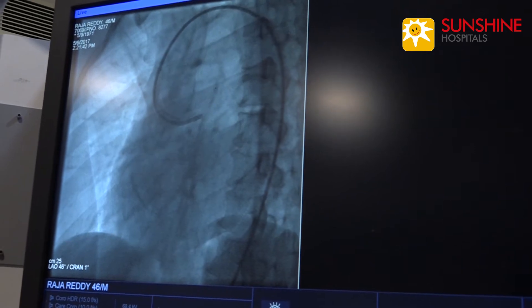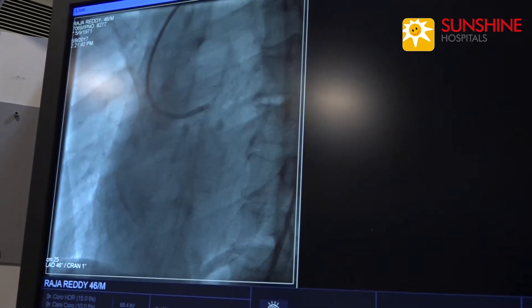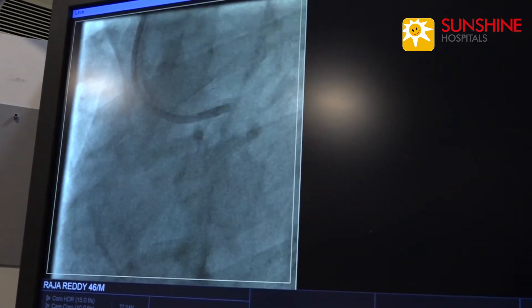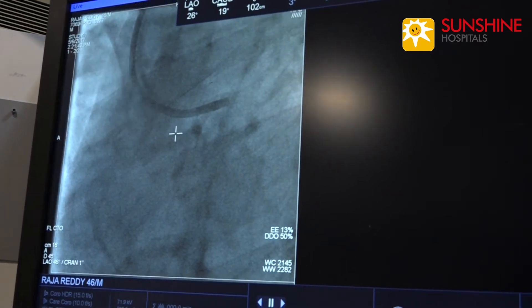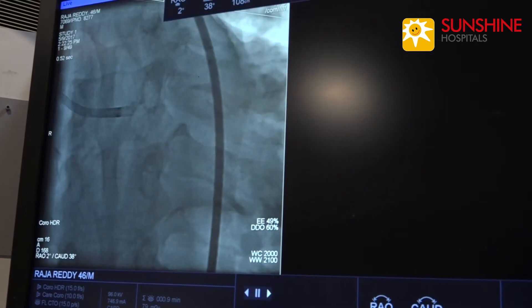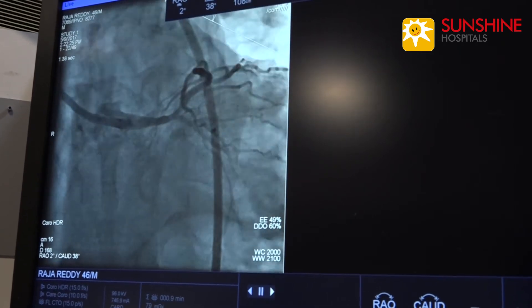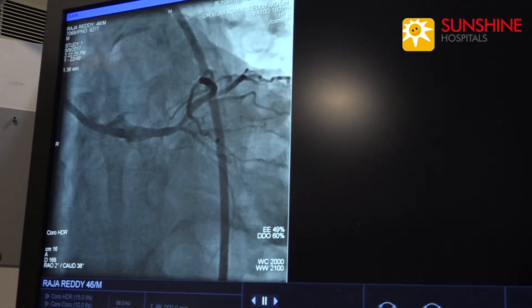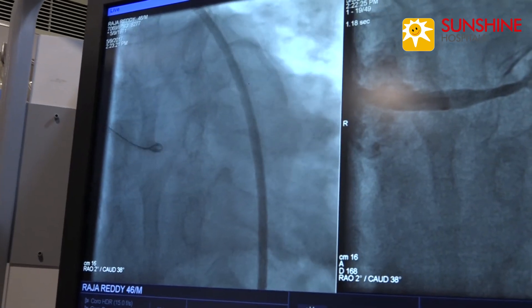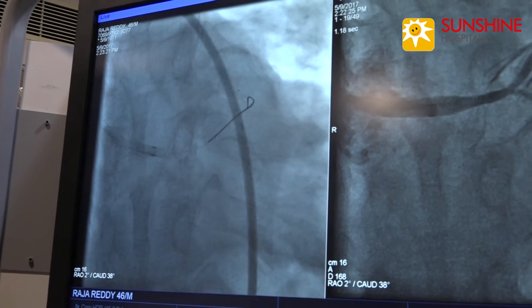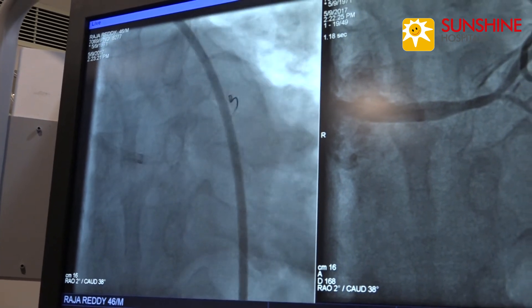Now we have engaged the left main with a JL4 guiding catheter. Now we are seeing distal left main and LAD disease. Now we are passing the wire into the LAD.